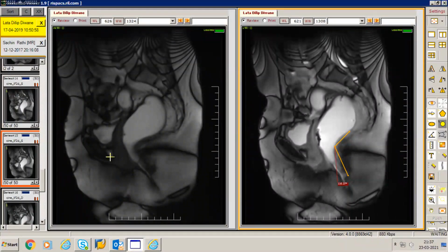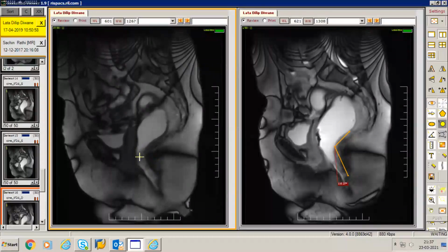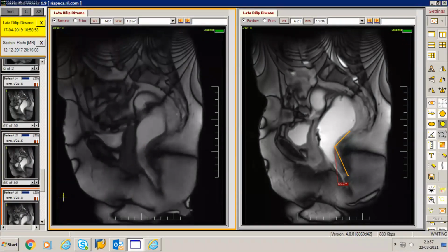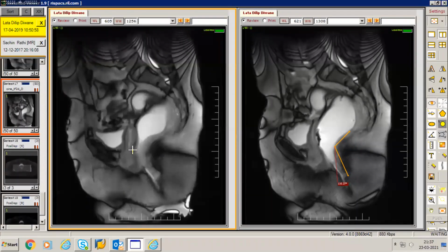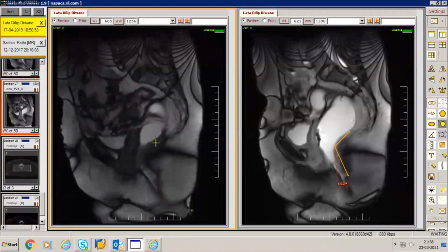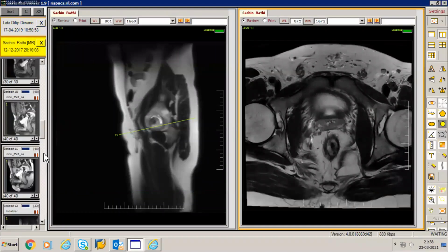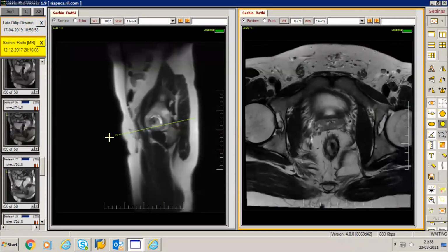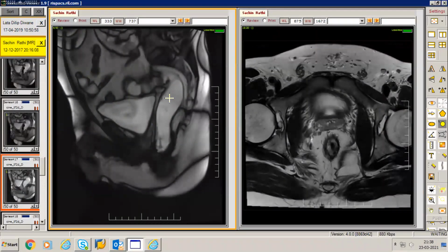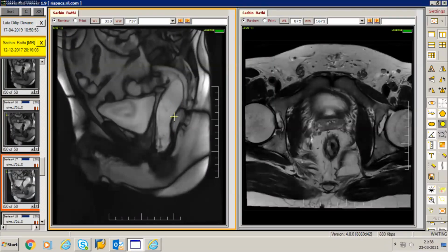In the last phase, the patient is asked to actually defecate on the table, wherein you would ask the patient to pass off as much as he can. Now you can see that the rectal jelly is coming out of the anal canal over here. I'll probably take the other patient, which will show the angles much more clearly. Yeah, so this is seen much more clearly in this patient, where you can see the defecation happening, and all the contents of the rectum coming out into the anal canal, and there is almost straightening of the normal anorectal curvature. So now this angle is becoming nearly 180 degrees, not really so, but as far as possible it straightens out so that the entire contents can be expelled.